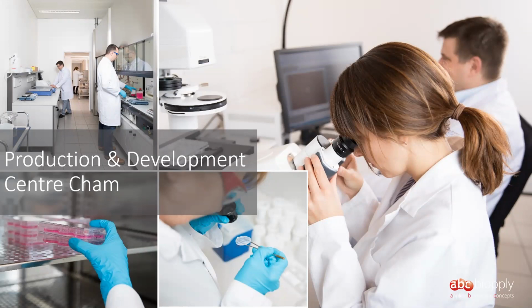The chip 200 is mainly used for long-term cultures. The individual spheroids are a bit more separated from each other, which means they can be kept in culture for a prolonged period of time without consuming too many nutrients from the medium. And the chip 880 is mainly used, for example, for clonal growth of spheroids or for experiments whereby I need a large number of similarly grown spheroids under the same conditions, such as, for example, extracellular vesicle, but also that relapse experiment that I showed before.